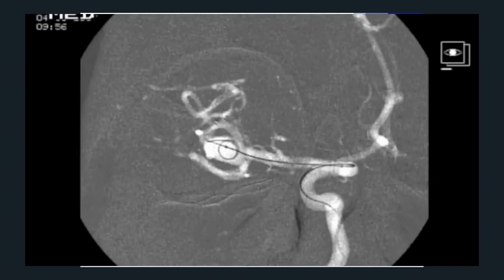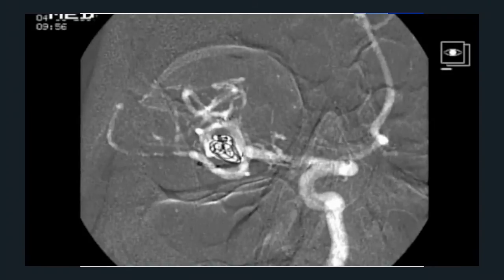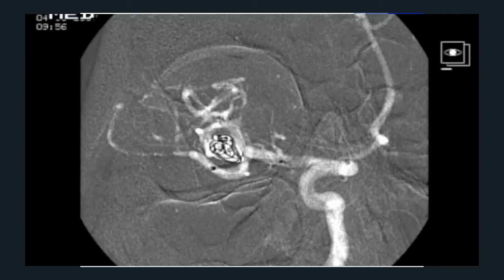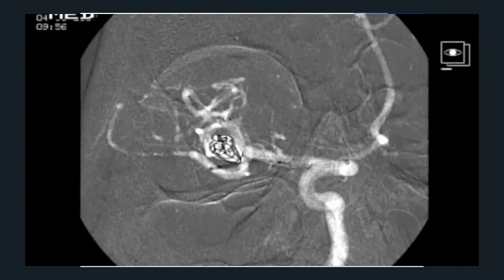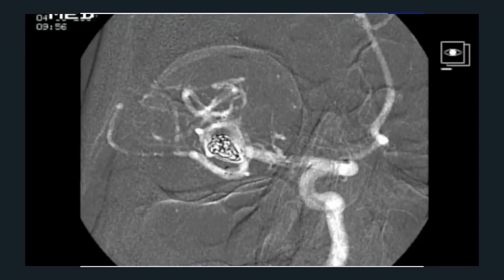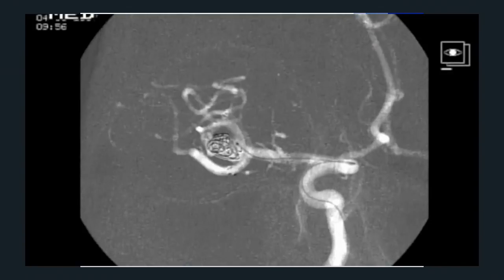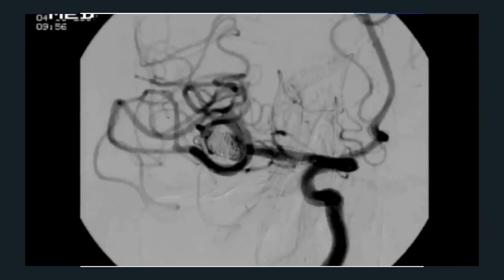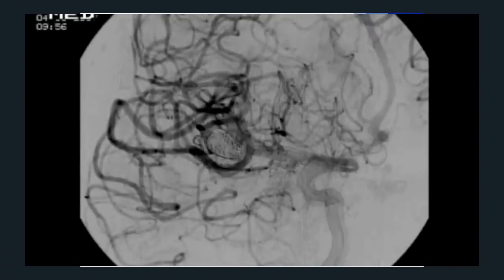Now, unfortunately, that didn't happen in this instance because this first stent, which went from this vessel into the upper vessel, protected the upper vessel, but you can see right here, there is a little herniation of the coils into the lower vessel, okay? And we're doing this all real time. We can see this happening on the X-ray machine. So very quickly, we just go up with another stent device, and here it is in the lower vessel, and you can see how right there, when it opened up, it pushed the coils back into the inside of the aneurysm.